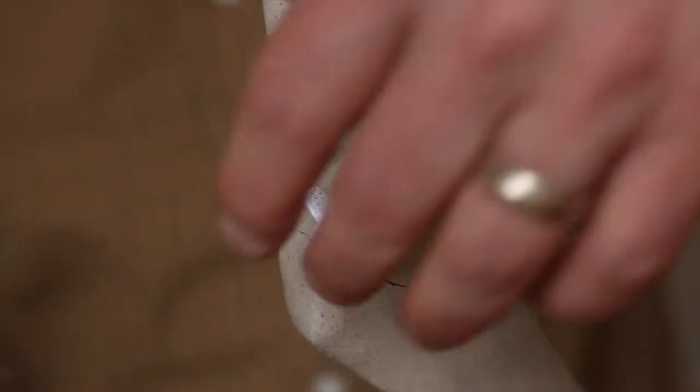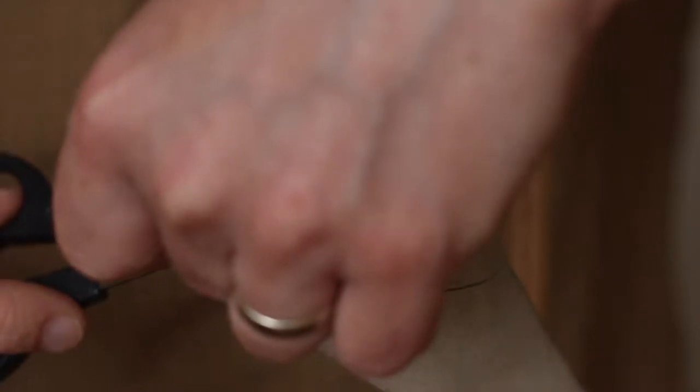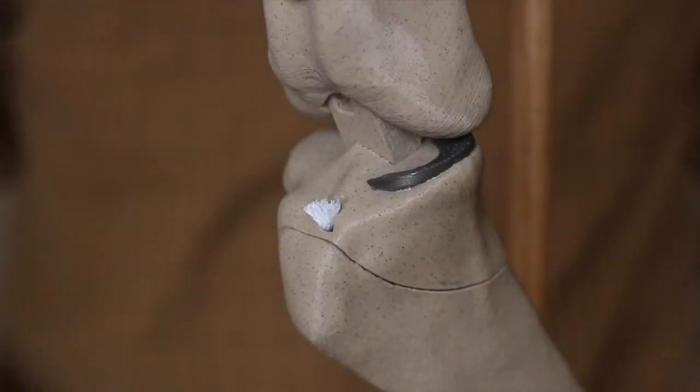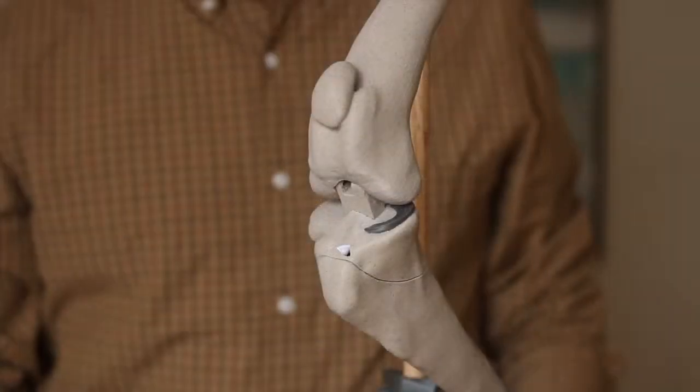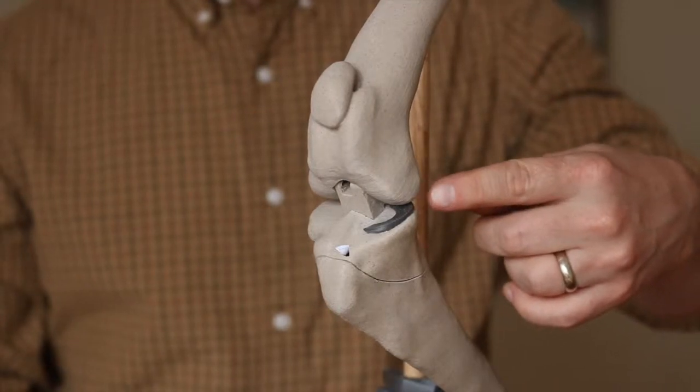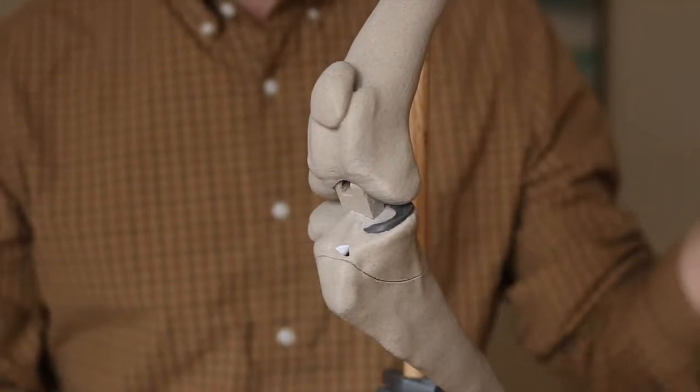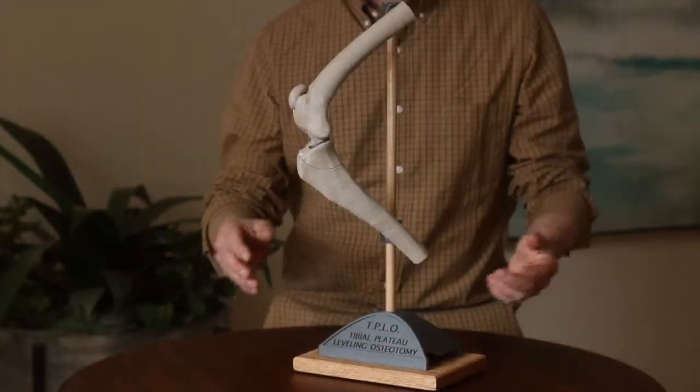In surgery we remove the remnants of the cranial cruciate ligament, and then we also take a very close look in surgery at the medial meniscus to see if there's any damage there. And if there is tearing of that back end of it, you remove that portion, that damaged portion.